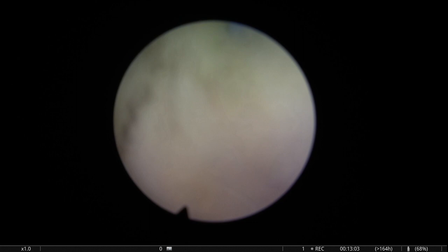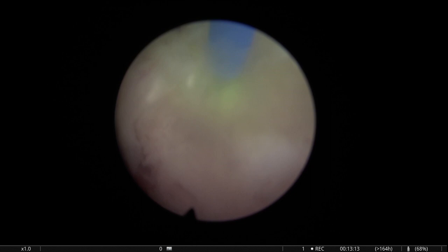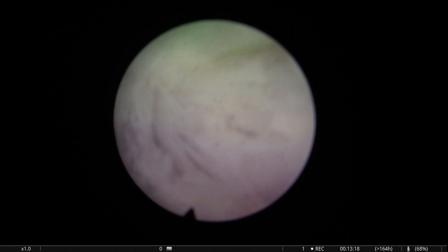So here is where I miss the pulse modulation, which allows for much better cutting. So you have to go slowly. And we use an Auriga laser in Sofia, Bulgaria, for these cases. It is a 50 watt laser.